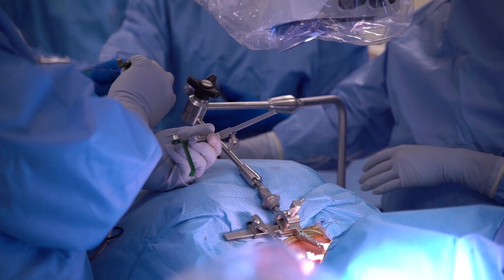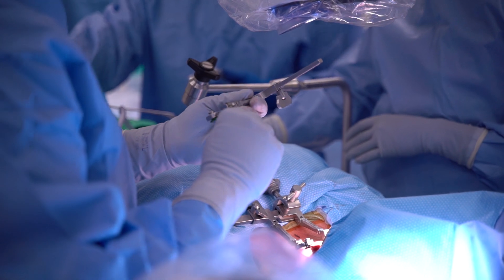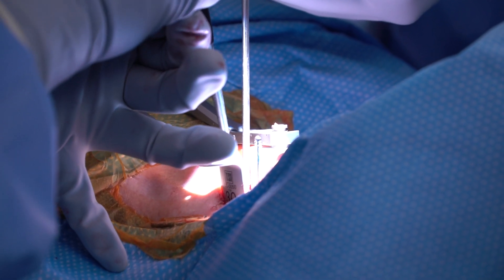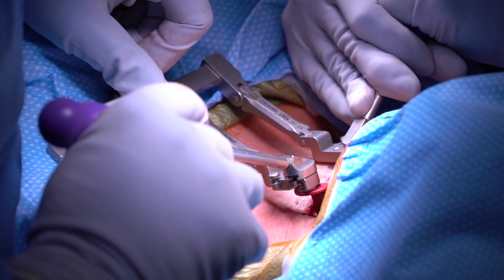Some of the older iterations had swivel blades, which are frustrating because if you have to move or adjust slightly, the swivel on the blade will lose your entire access and you basically have to close, reset, and reopen, which wastes time. Every time you adjust the retractor there's always a chance of some variable change — pressure points or tissue creep that you don't want. We try to minimize that, and the fixed blade, once it stays and locks in, allows us to maintain that access.